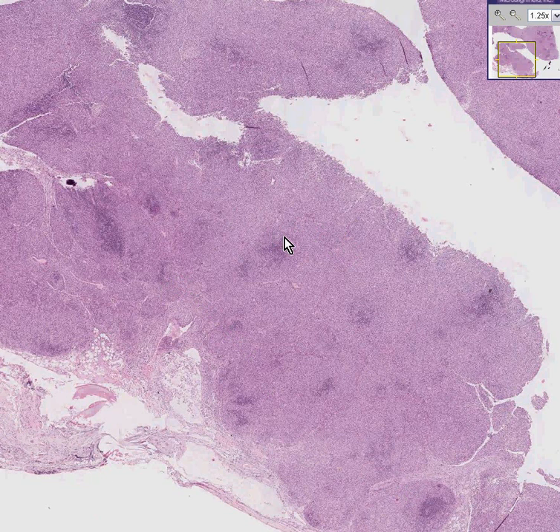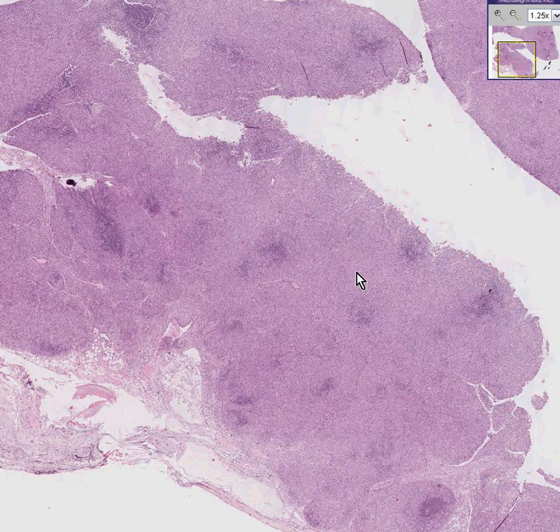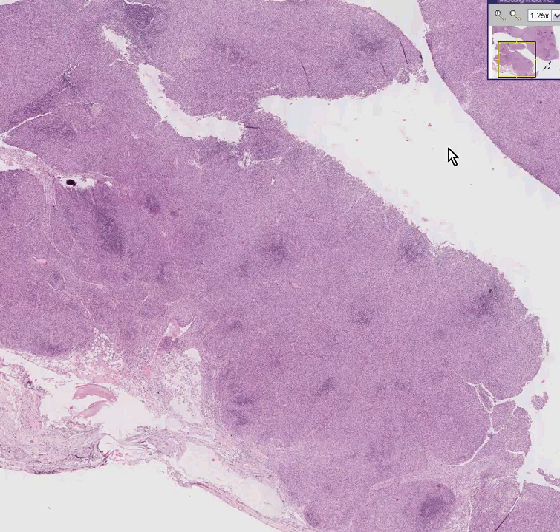That makes this a malignant lymphoma. This one happens to be called a peripheral T-cell lymphoma, because they stained these cells with T-cell markers and they were positive rather than B-cell markers, and that's another way of classifying lymphomas.